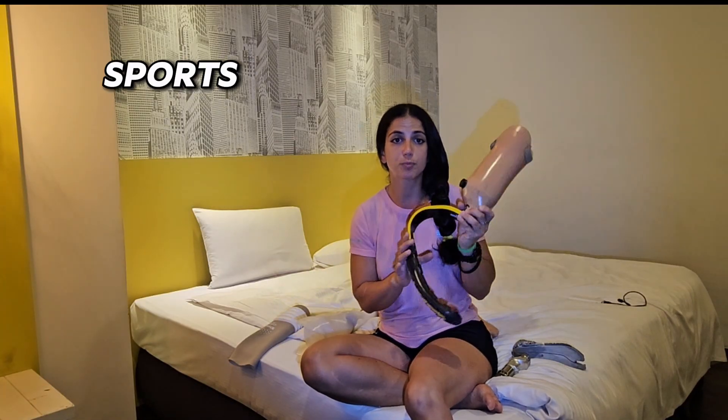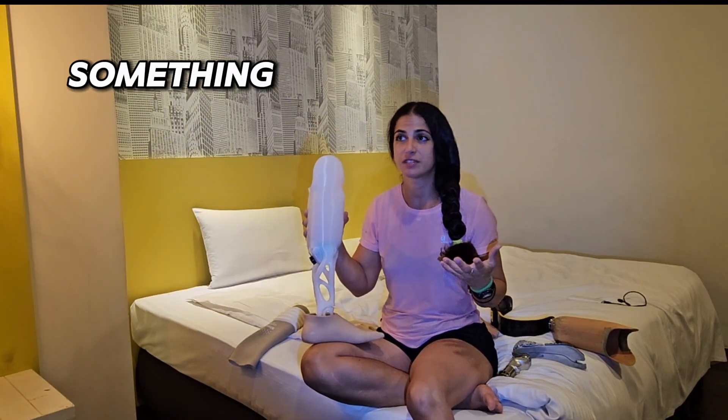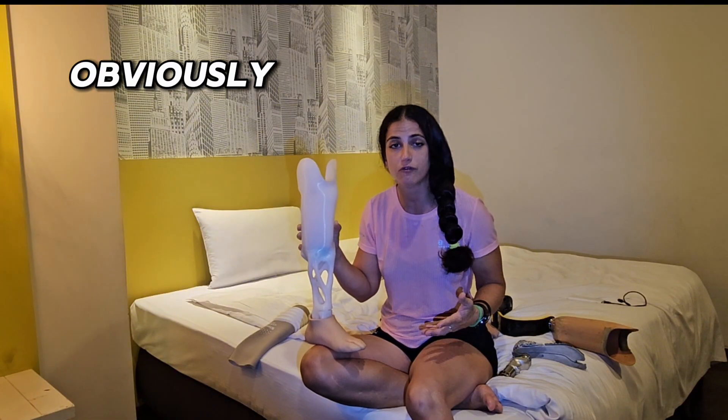Whatever you feel comfortable with, I would suggest using that for walking, because most of the time we need a foot for walking or regular activity. Other feet like this one are for sports, but we don't use that all the time. Let me know if you have any questions — if something doesn't convince you or there's something you still don't understand, I'm here to answer.